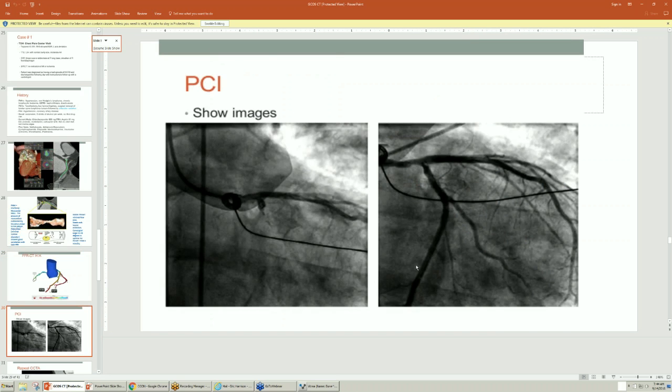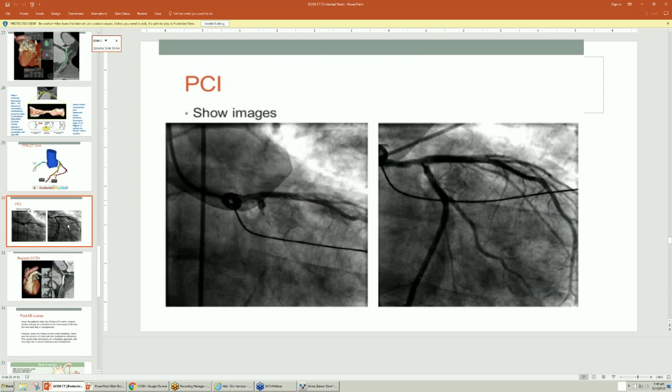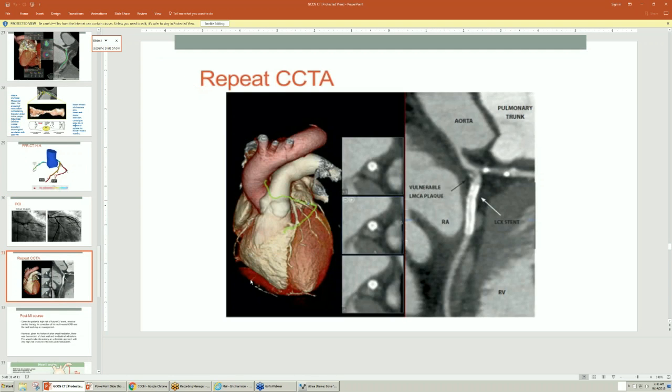So this is to show you how significant that vessel was, in terms of, well, it ruptured and it occluded. This is the parrot's beak sign of a fresh occlusion with contrast, and this is after it's been opened up and stented. And then we can show you pictures of the intact stent afterwards. You can see that the occlusion was exactly where we predicted that it would be because of the hemodynamics and the composition. So that's really proof of the pudding. Took 188 days to get there, but that's proof of the pudding that what we were saying was right.